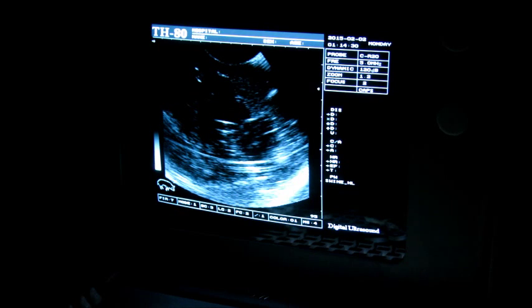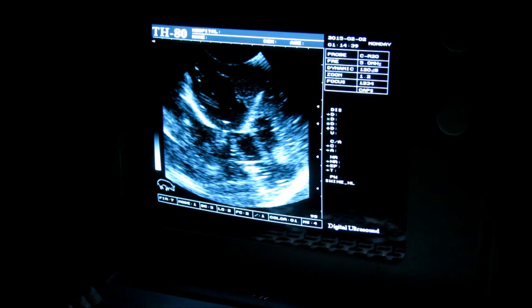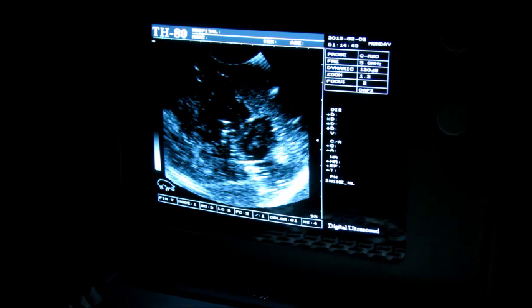You can set multiple focal points on all of our machines. With the TH80 it's just a click of a button. It's worth remembering, however, that this will significantly slow your frame rate, so I wouldn't recommend doing this.